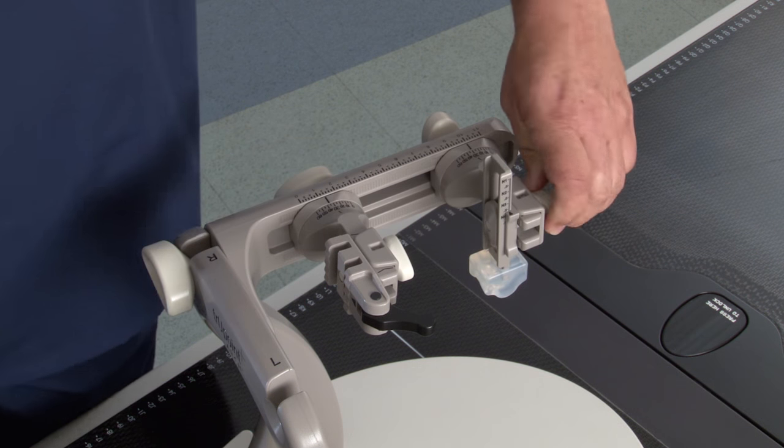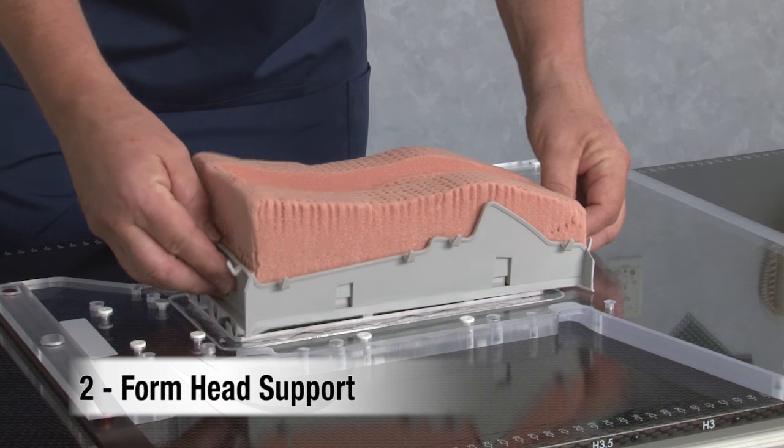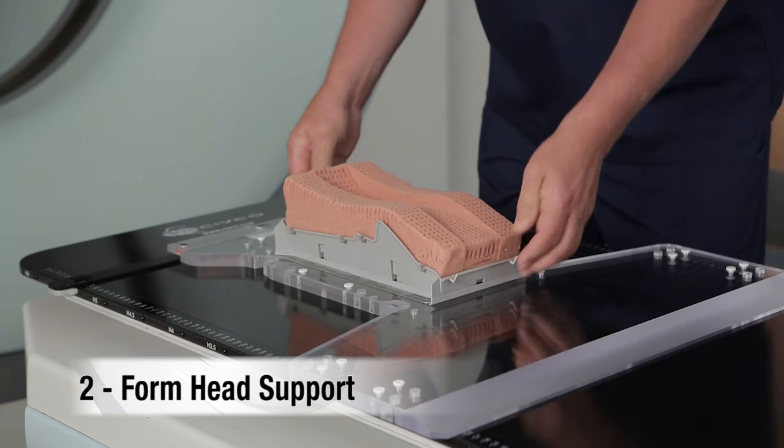Make sure the positioning indicators are facing up. Next, place the individual head support on the base plate, ensuring the proper orientation.